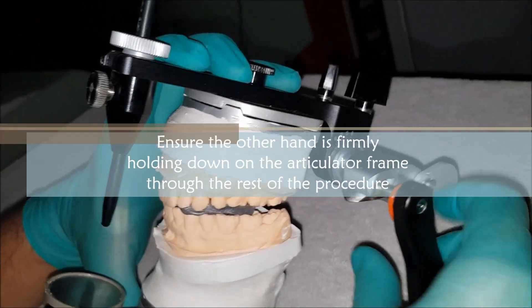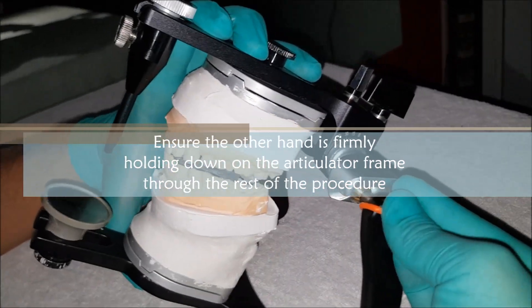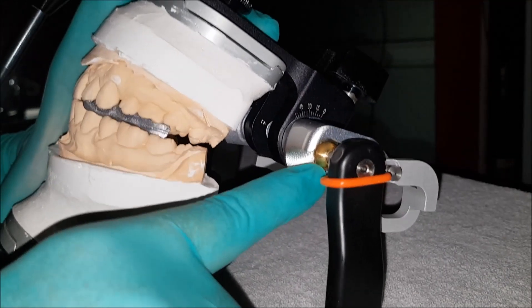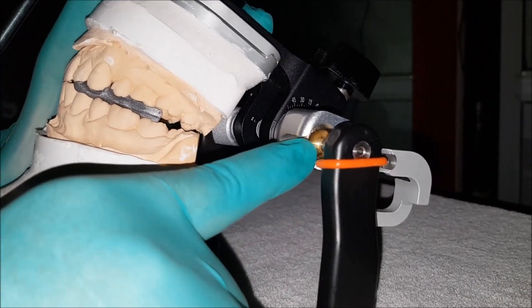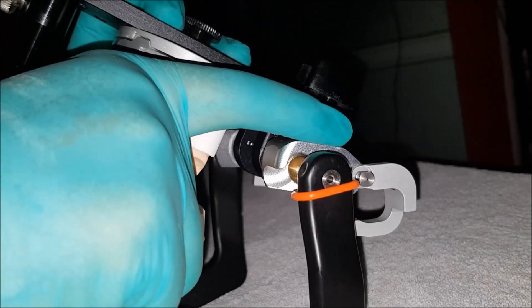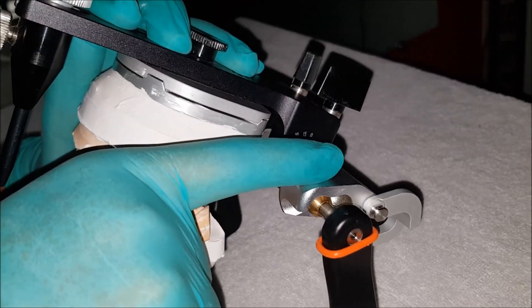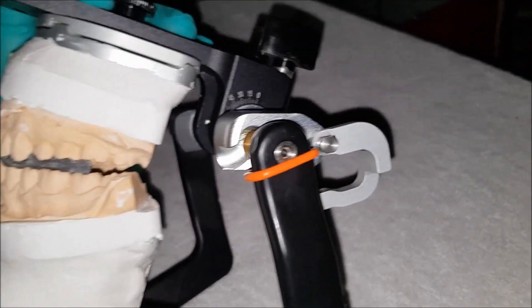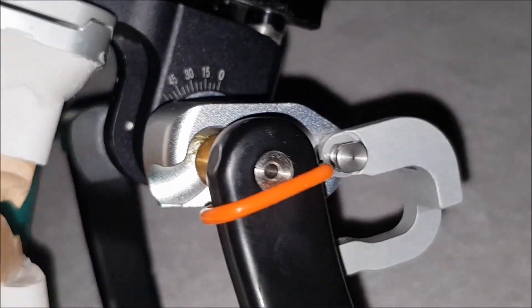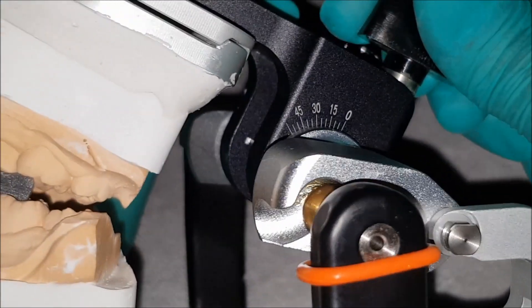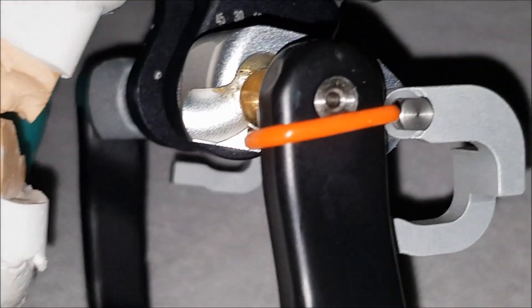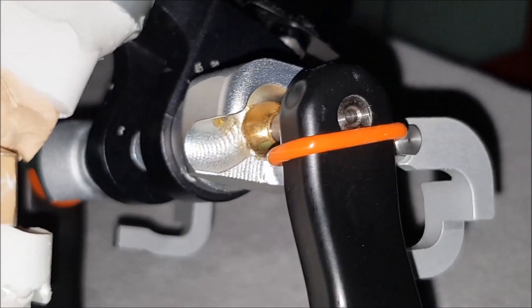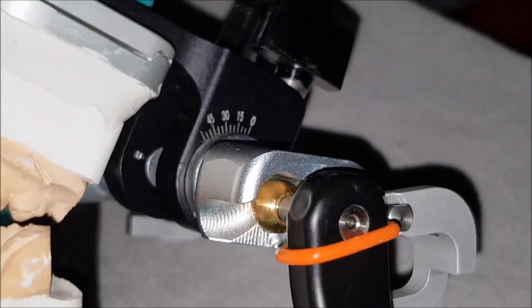At this point, when you look towards the back end of the articulator, you are able to appreciate that the ball is no longer in the fossa, but it has translated out of the glenoid fossa because this is a protrusive relation. Now, as I zoom in, you will be able to appreciate that the ball here is not actually in contact with the fossa. If you look closely, there is a slight gap between the top of the ball and the top of the fossa.